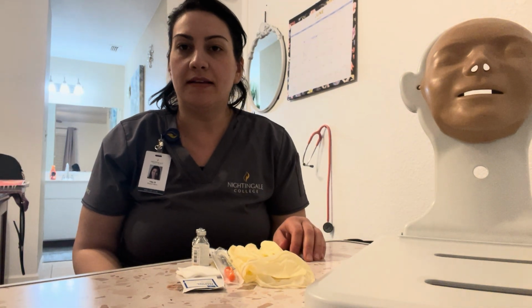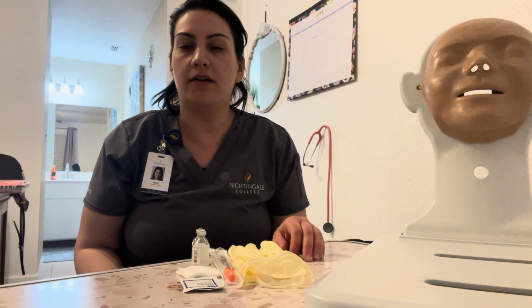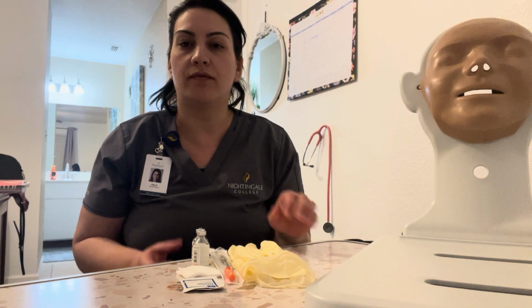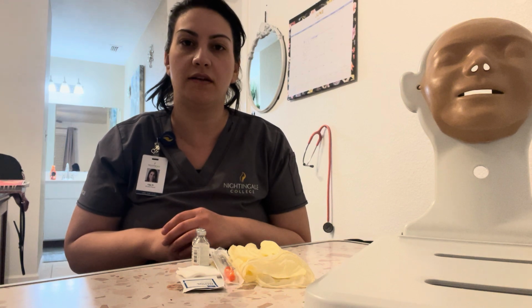I'm going to be performing the skills video of drawing up insulin. I want to start off this video verifying the physician's order and going over the 6 rights of medication: right patient, right drug, right dose, right route, right time, and right documentation.